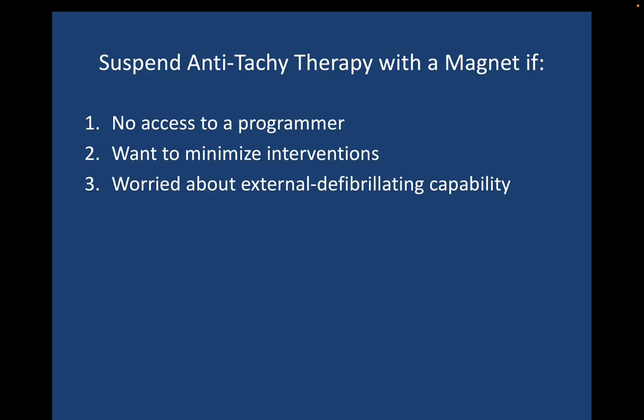A magnet's great if you're worried about external defibrillating capability of the people who are going to be in the room while the patient's under anesthesia. If you don't have somebody that you can reliably count on to defibrillate the patient, you don't happen to have a defibrillator immediately available, then a magnet is the best way to go.